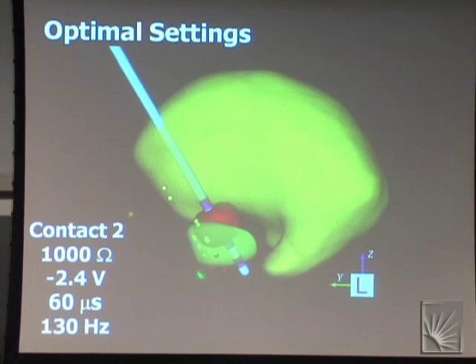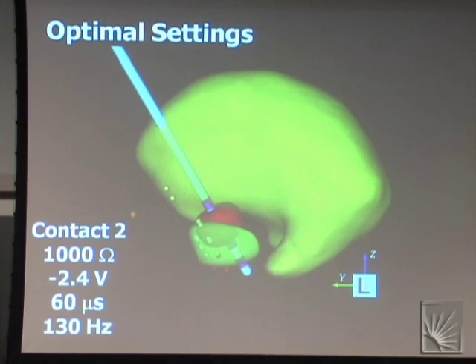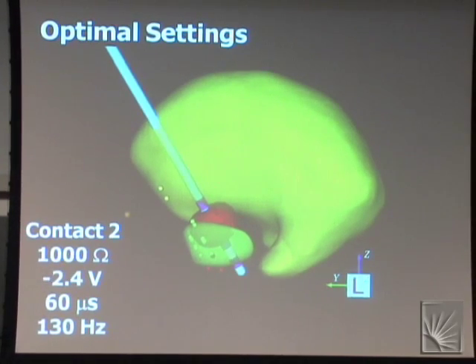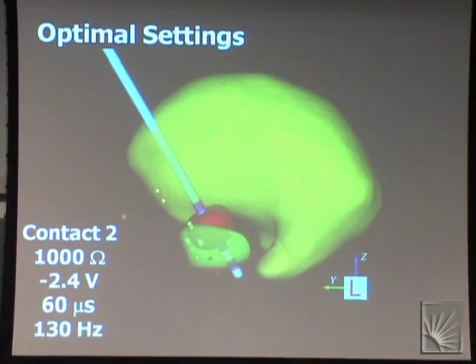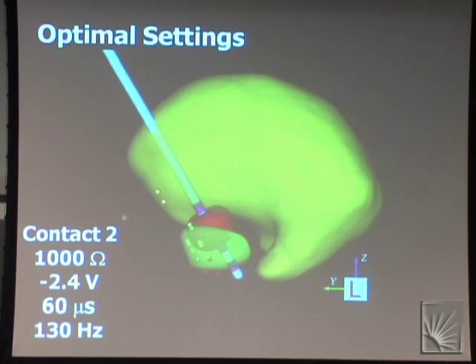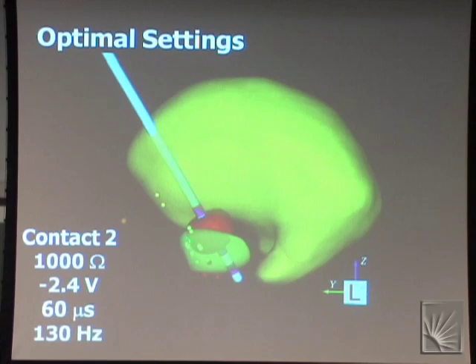But if we made a transition to relying on this type of technology, you may think about a different philosophy. You get an initial track, and then the next track isn't necessarily to find a border; it's to find a track that's going to constrain this brain atlas as much as possible. Because that's the issue. With one track, the brain atlas could still have many, many different permutations that could fit with both the MRI of that patient and those microelectrode recordings. But if you then get a second track, there are only so many positions that could happen, and so on and so forth when more tracks are collected. So that's what Luis is doing now.